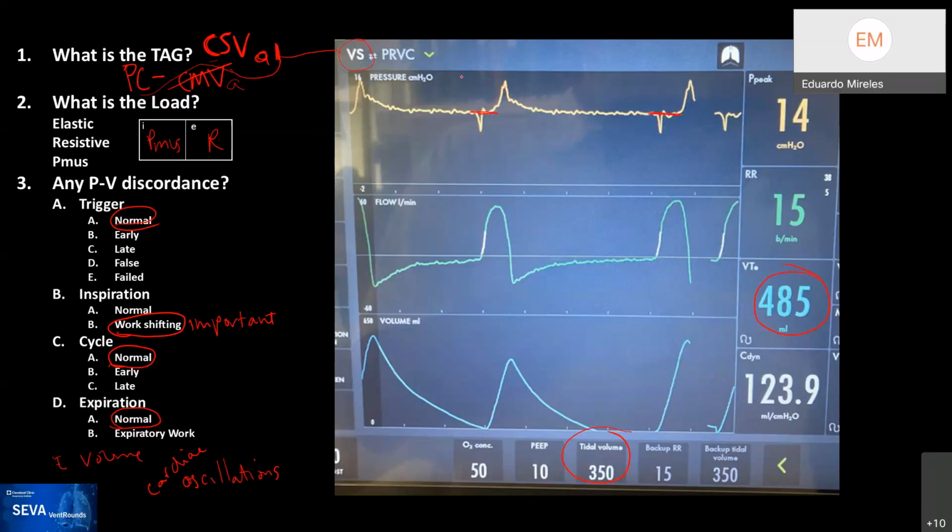So you could essentially imagine that during this part of inspiration, the patient is getting no support, and then while the patient is exhaling, the pressure goes up, and that's completely useless because the patient is now exhaling. This is just relaxation of the respiratory muscles or active exhalation.